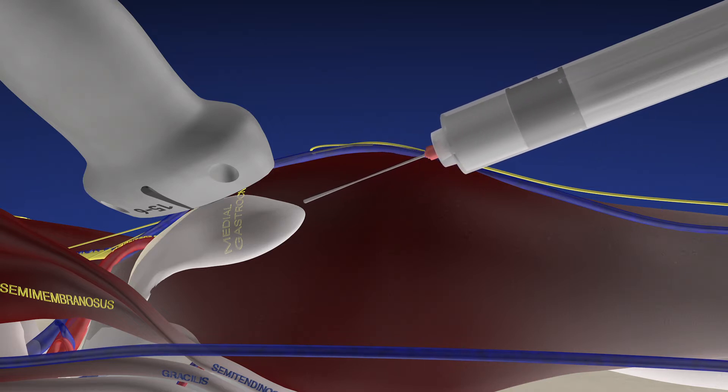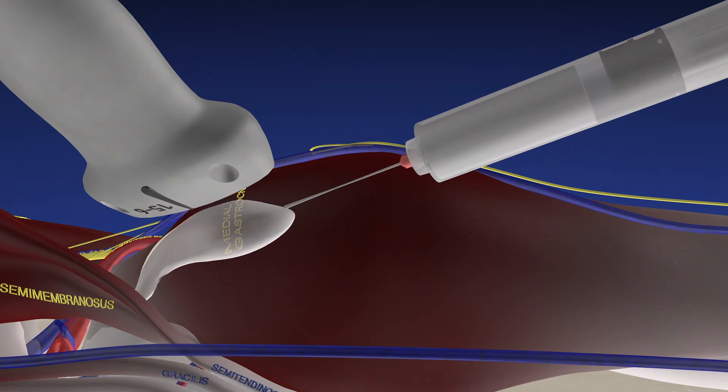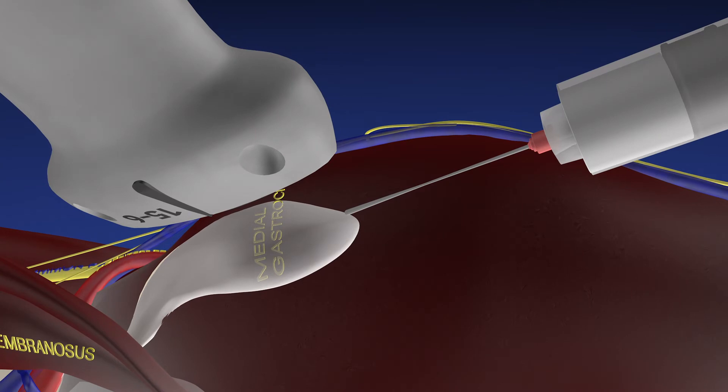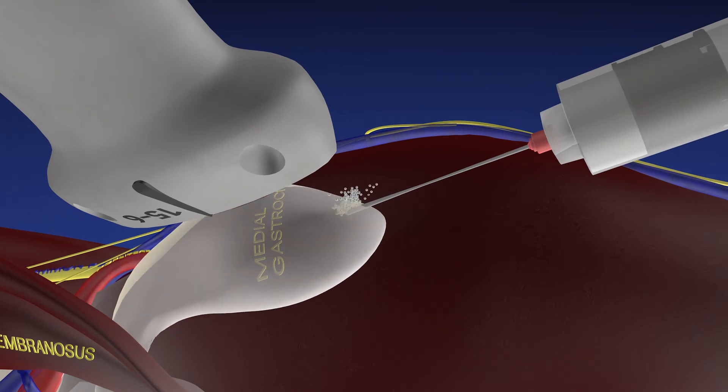So we initially drained some of the cyst, and now we're fenestrating it with the needle, trying to go in and out of the wall. Here we're draining some more — we weren't able to completely drain it since some of the fluid is quite thick. Towards the end of the procedure we are going to inject with cortisone.